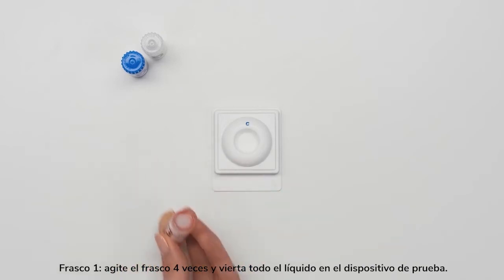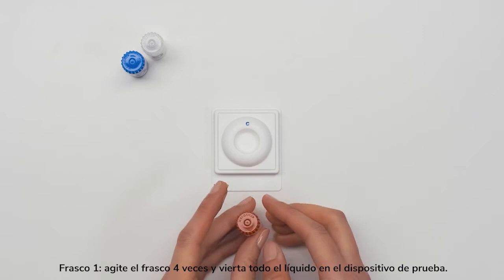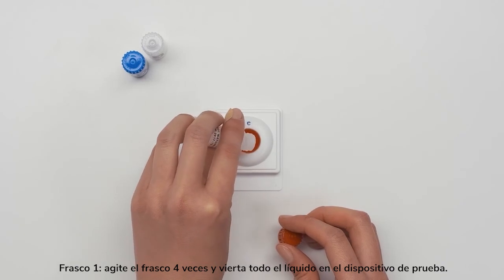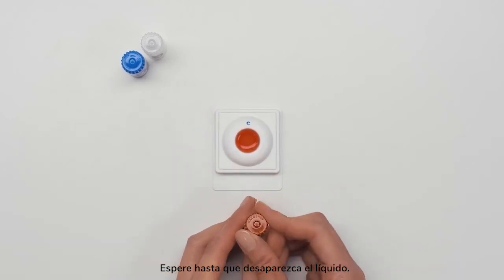Bottle 1: shake the bottle 4 times and pour all of the liquid into the test device. Wait until the liquid disappears.